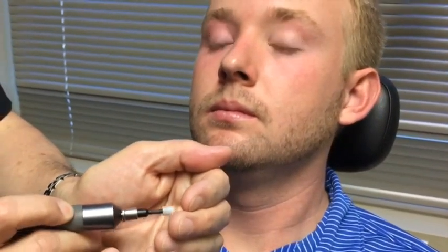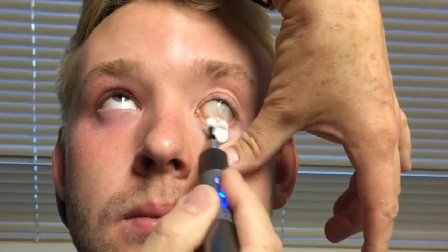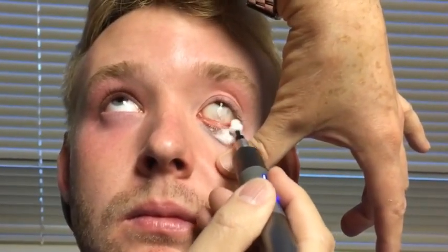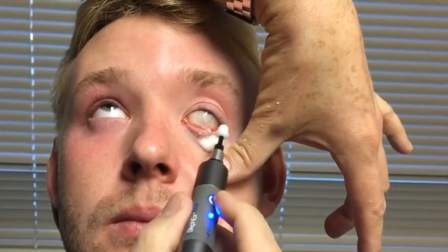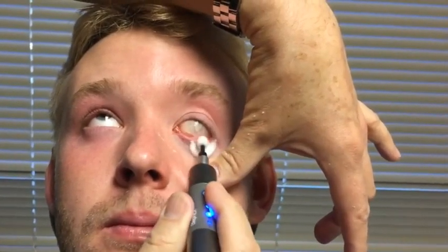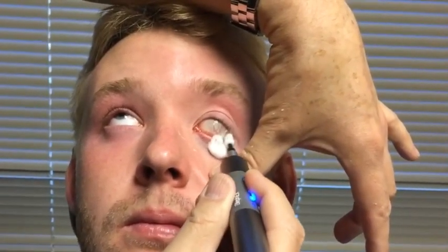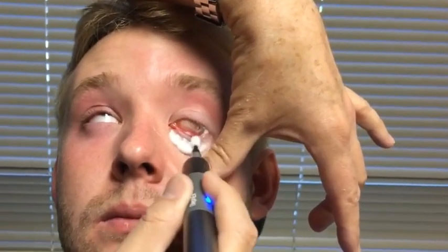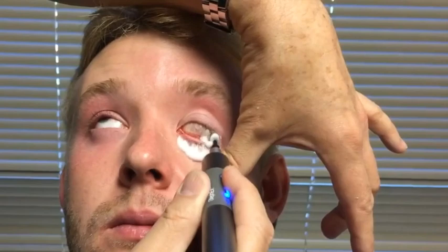So I'm going to start it again, 2 seconds down. That starts it. Shield the patient. Come around, and it's the same technique. Scrubbing, scrubbing, scrubbing. In the interest of time, I'm going to shorten this procedure. You guys get the idea. We're going to reverse it. Now again, that's much shorter than we want to treat. We want to treat at least 30 seconds spinning one way, and then 30 seconds spinning the other way.